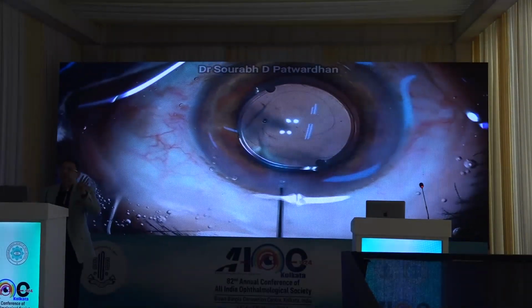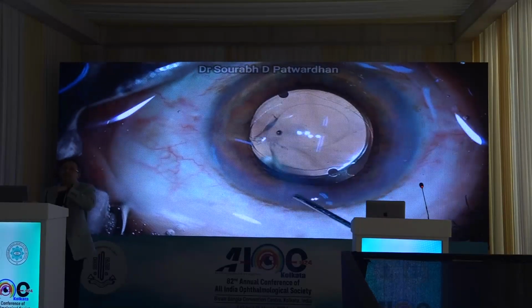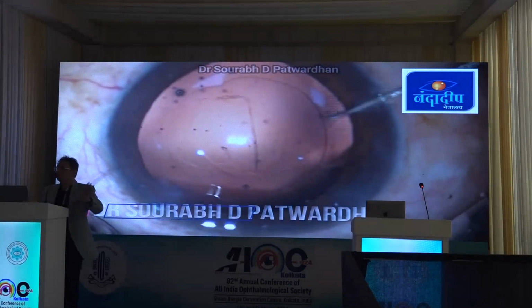If you have access to Centurion, you can just keep 20 IOP and then do the same thing. But this still works better, because when you take out the IA probe, there is always an AC collapse and there will again be some issues which might form. So I just wash this off carefully.